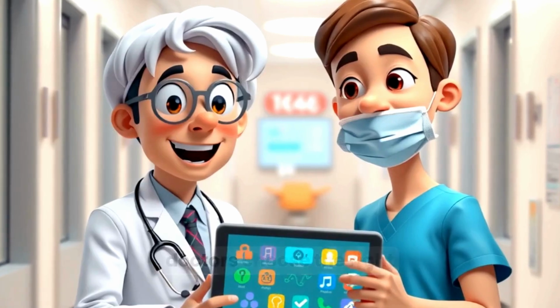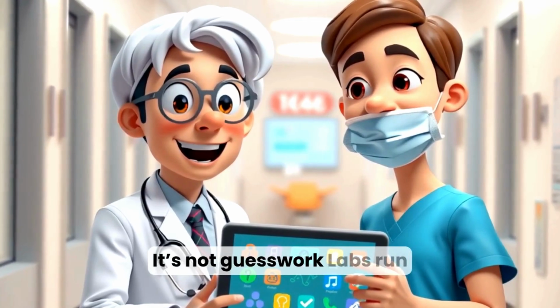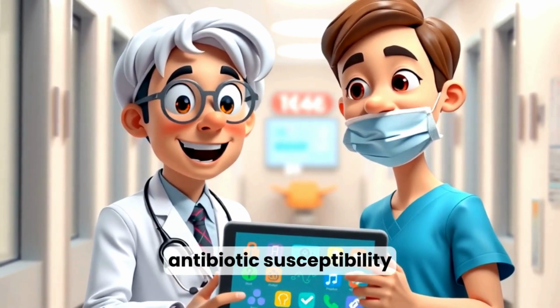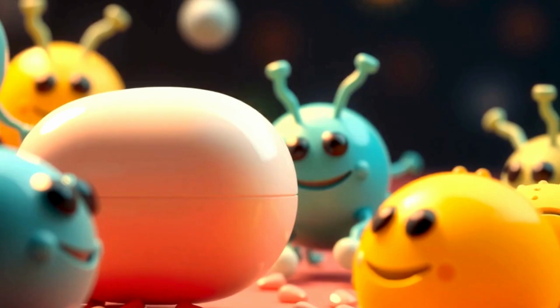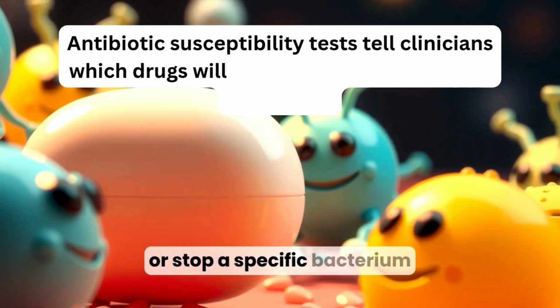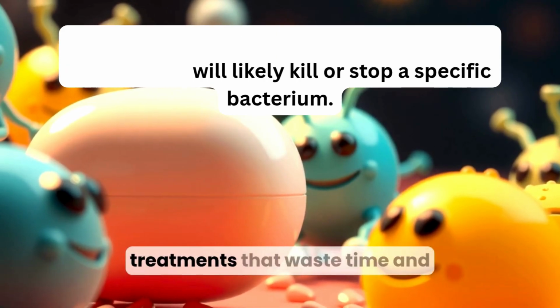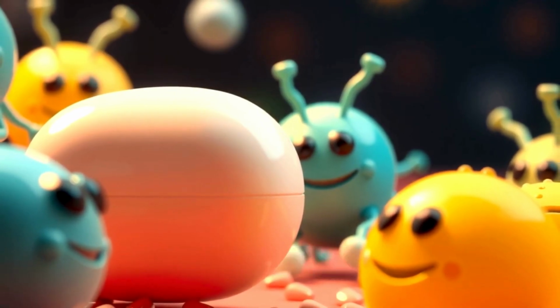Have you ever wondered how doctors choose the right antibiotic for an infection? It's not guesswork. Labs run antibiotic susceptibility tests to guide care. These tests tell clinicians which drugs will likely kill or stop a specific bacterium, improving outcomes and avoiding ineffective treatments that waste time and harm patients.